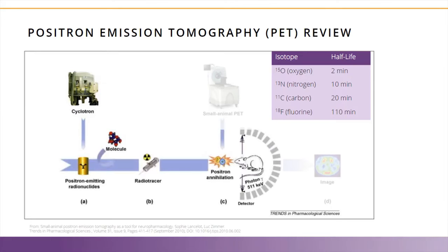Once the radiotracer is made in the cyclotron, and again, this must be a positron-emitting isotope, the radiotracer is injected into the animal model to be used for imaging. We will discuss some specific examples, but an easy example would be to inject FDG, the radioactive isotope of glucose, for detecting the tumor. This may be injected into an animal suspected of having a tumor, or perhaps a metastatic tumor model where it is not known where these tumors may be forming.